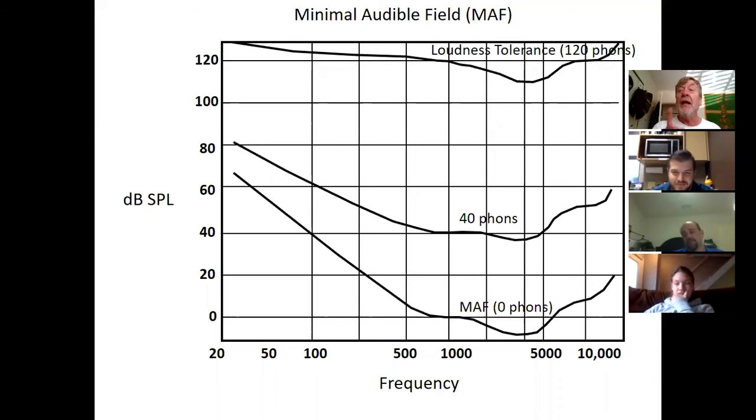Now, we don't test hearing with both ears. We test hearing with one ear at a time. Some ears are little, some are larger, but nonetheless, right ear, and then left ear, just like you do your vision, test one eye at a time.